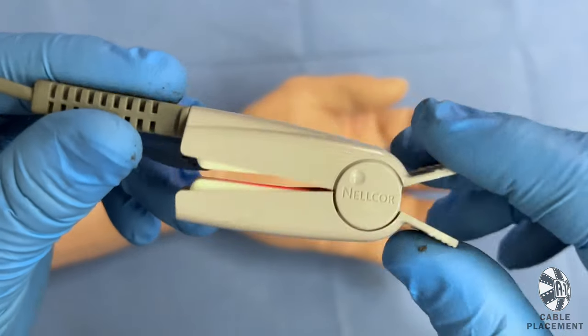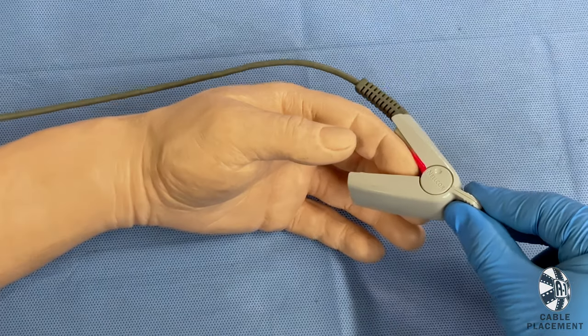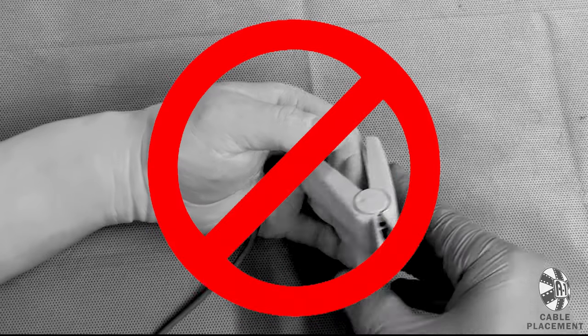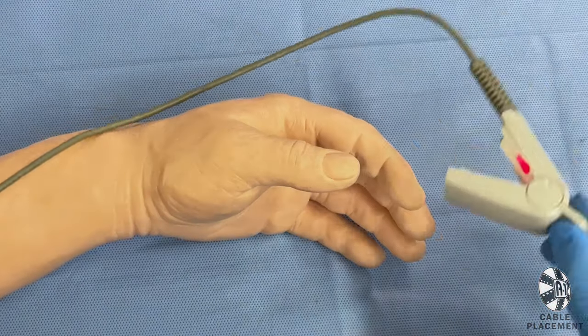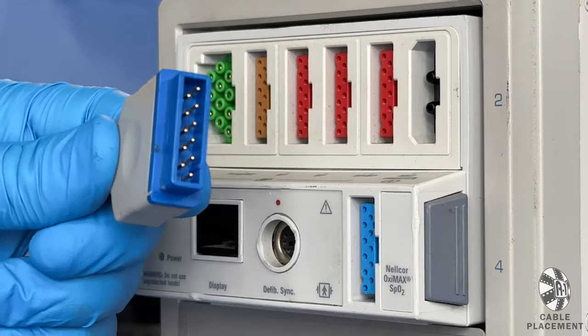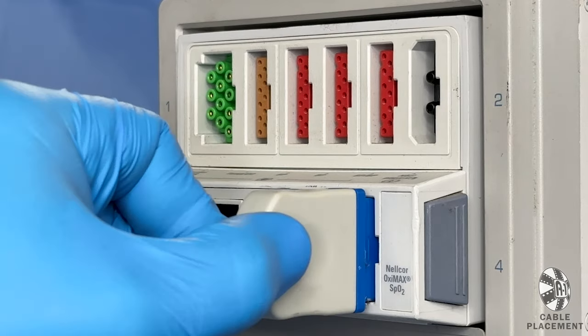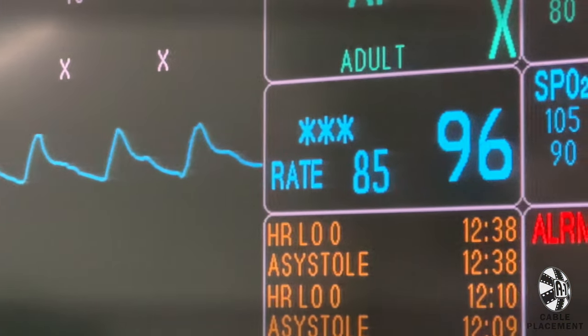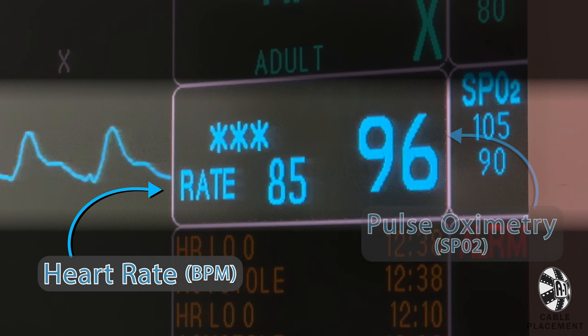For pulse, place the pulse oximeter finger probe on their index finger, making sure the cable goes on top of their hand so they can still grip unhindered if needed. Now plug the blue cable into the blue input. On the same row, the monitor will show the actor's heart rate and pulse ox rate.